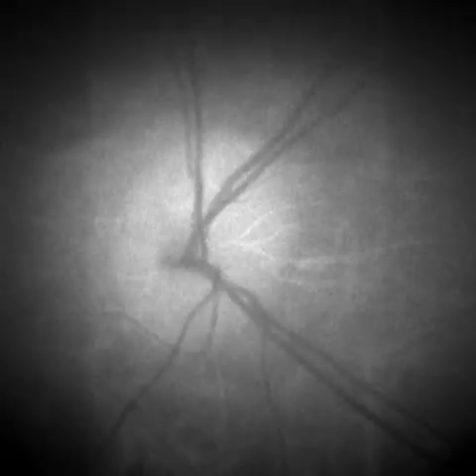This is real-time laser Doppler imaging of the retina by ultra-fast GPU rendering of holograms. Eye conditions are major global health issues that demand continuous improvements in monitoring devices. Ophthalmologic imaging has been revolutionized over the past 2 decades by optoelectronics, and it has driven the current evolution of eye care. Digital holography heralds a new global transition to digital ophthalmology, which will allow the transfer of analog optical methods to the digital realm.